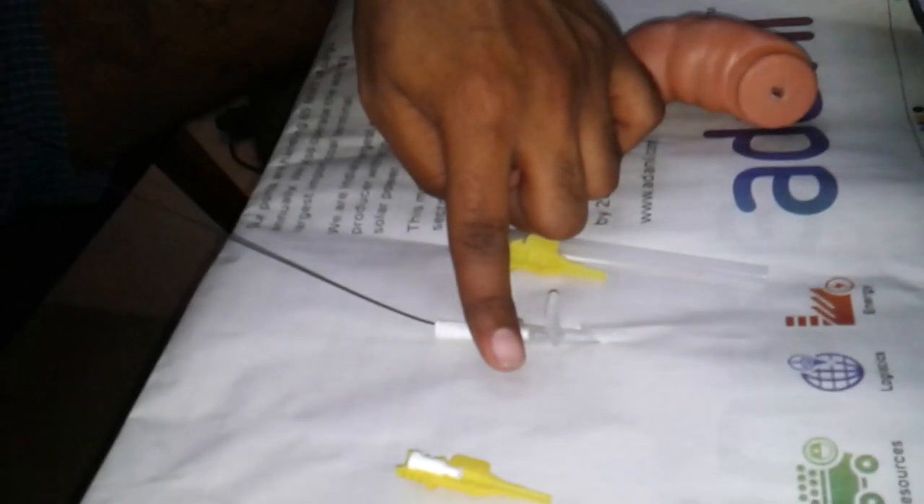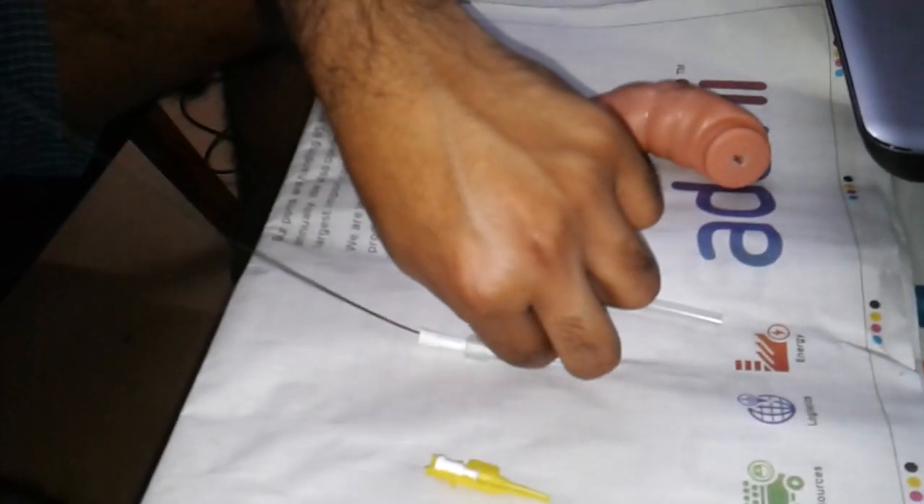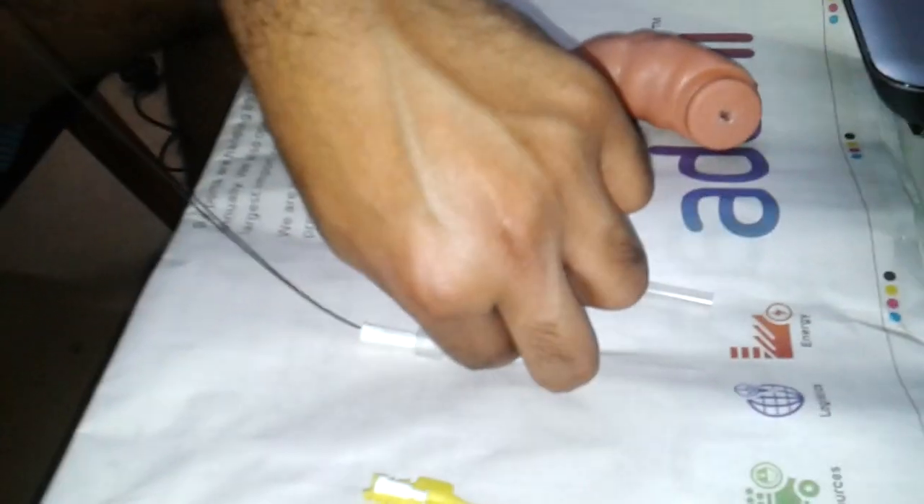Now we push the guide wire inside and lock it. We have to take the guide wire out from that hollow tube, so we push open it and push it back. The guide wire is out, and you can see this hollow tube is still going to the heart. The line has been made — you can see the guide wire is near the heart.